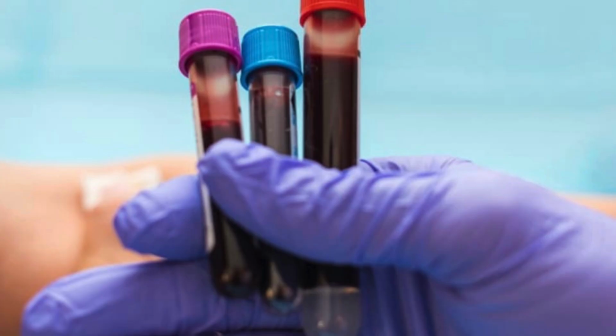These are the only tubes I have. The blue, red, lavender, and gray remain in the same order, even if I'm not using the yellow and the green. So stick around if you want to get more information about the tubes and the different types of tests that we use these tubes for.